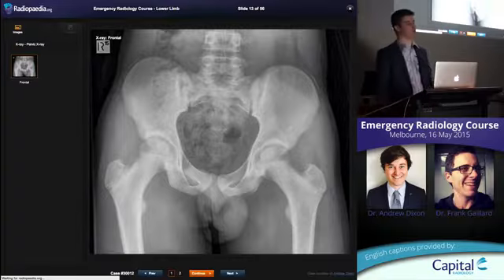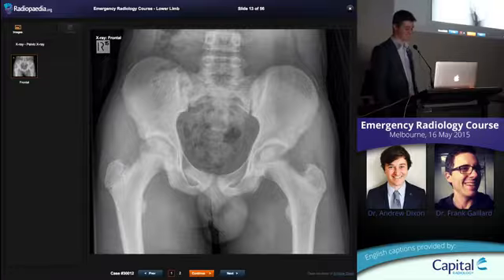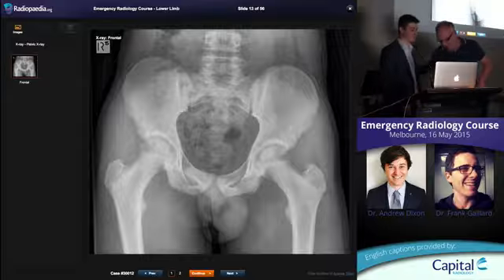There was one of our people who were watching online who said, as much paediatric emergency radiology as you can. So I've kept this little bit in, mainly for him. Come along, Garth, you're going to have to talk to me. Oh, no. Can you remember completing the quiz and getting this one right? Yes. So stand in front of the mic and just point out.